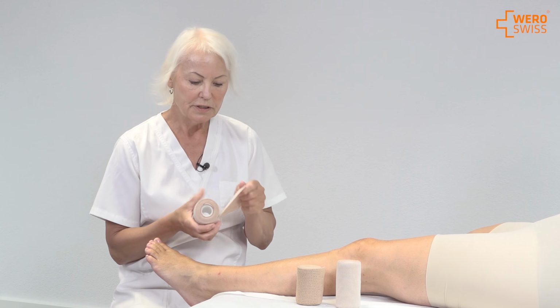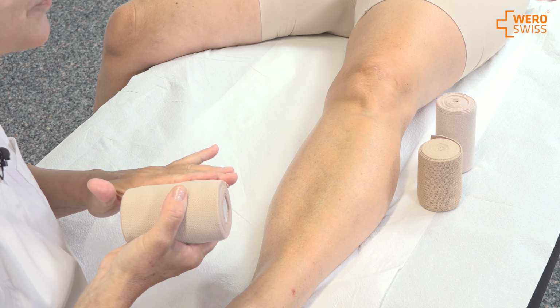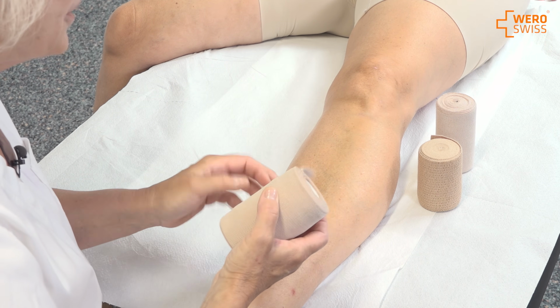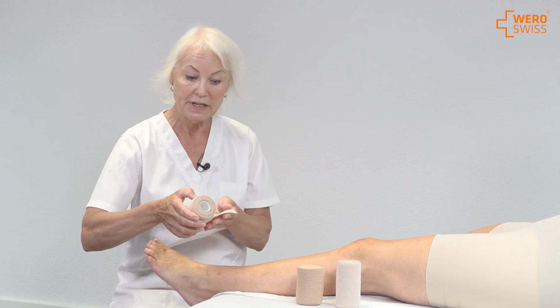This bandage is very firm, and when you bandage with this material, it sticks to itself. It doesn't stick to the patient's skin, and this means that when you use it, it can be like a light cast and it can stay on for several days.